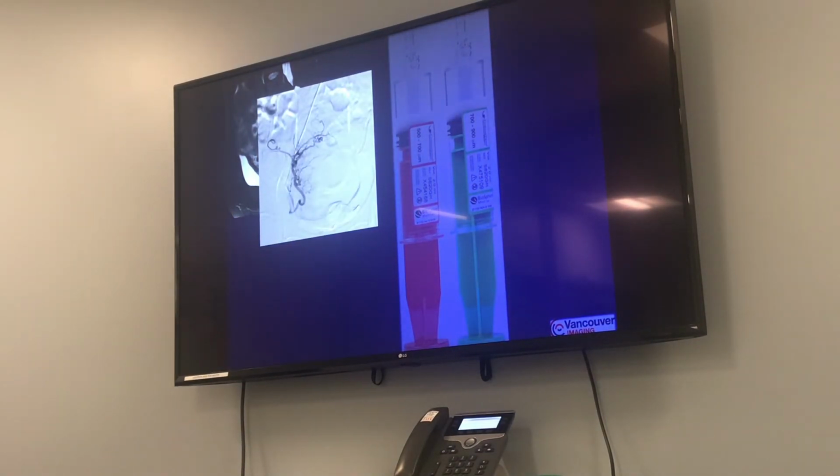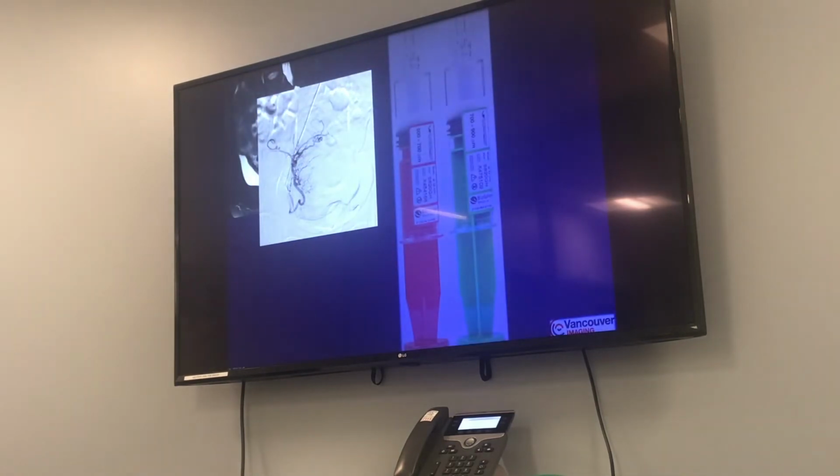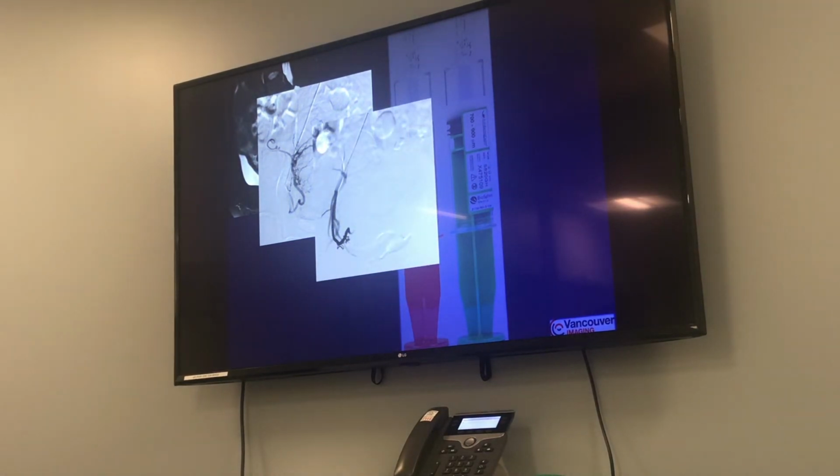And so again, there you can see all those very abnormal blood vessels, all these little squiggly things. These are all blood vessels supplying the fibroid, and this squiggly one is the uterine artery. The uterine artery, no matter who it is, always looks exactly the same. And that's at the end. So you want to see all those abnormal squiggly lines gone. That's all the blood vessels supplying the fibroid.